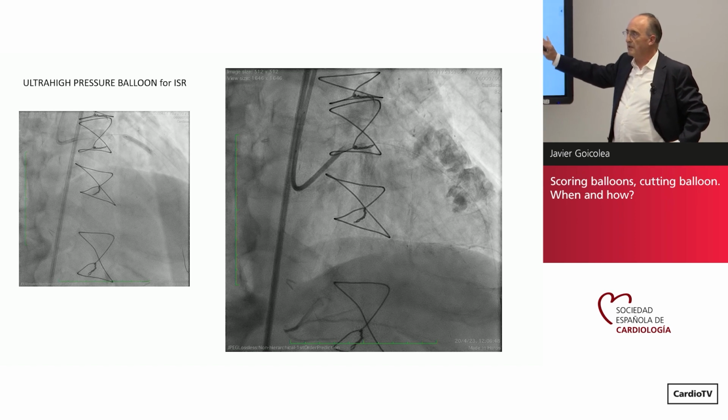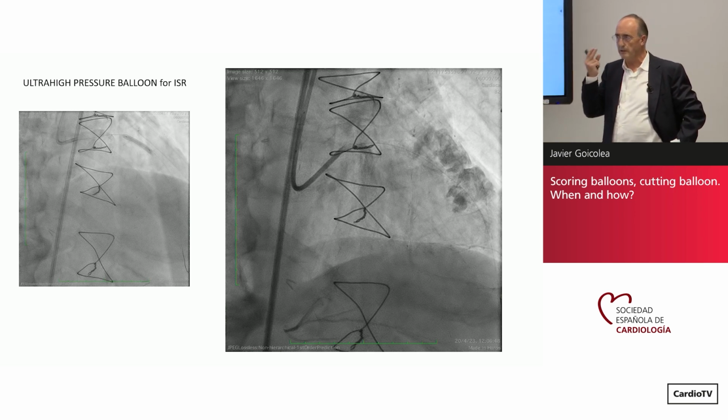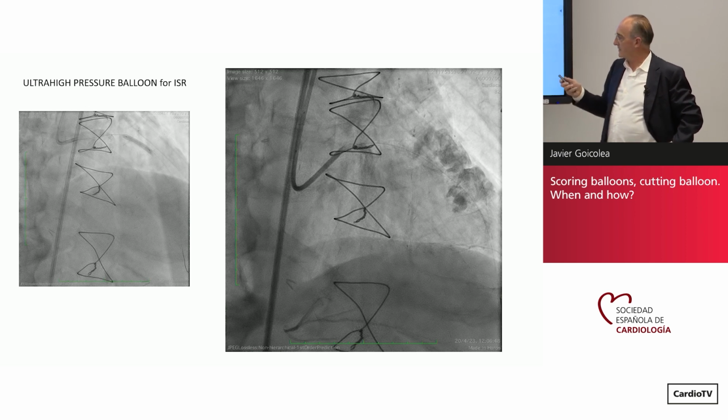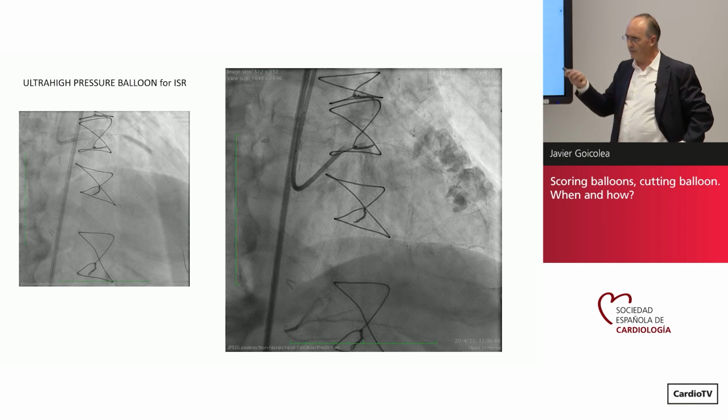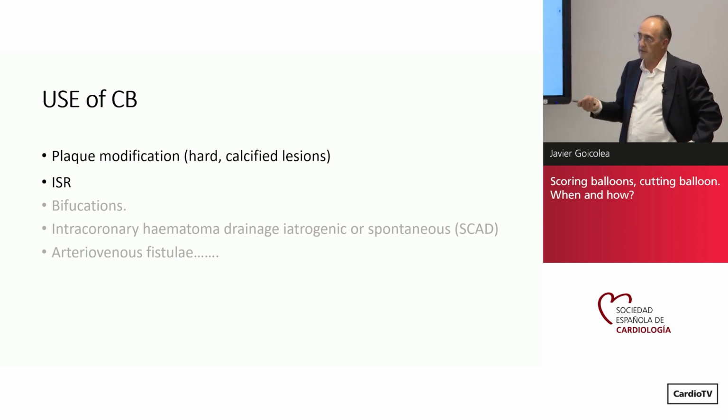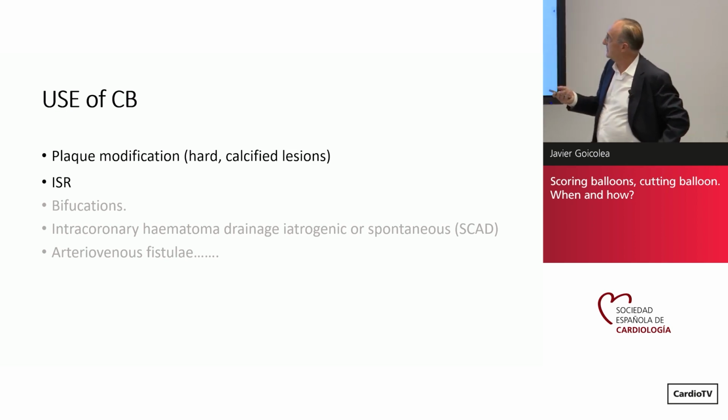That's the question. I mean, 30 atmospheres. It wasn't 45, 30 atmospheres, and we looked at it with intravascular ultrasound. Maybe it wasn't easy because it was calcified, but 2% ruptures or perforations, I think that's something to worry about.